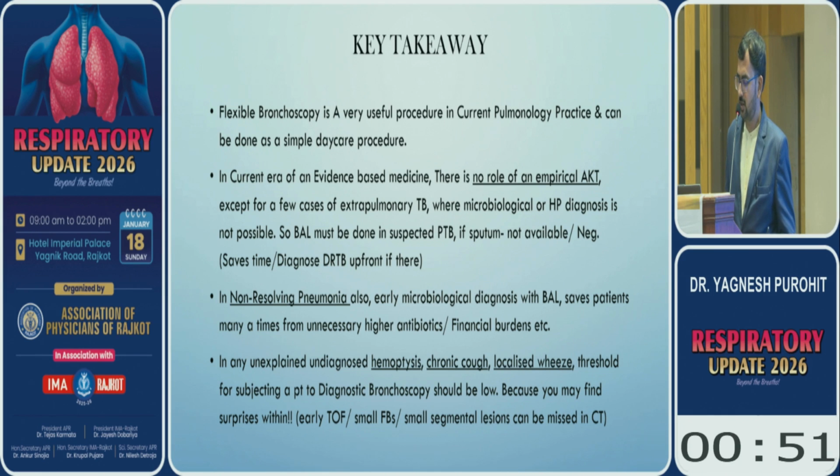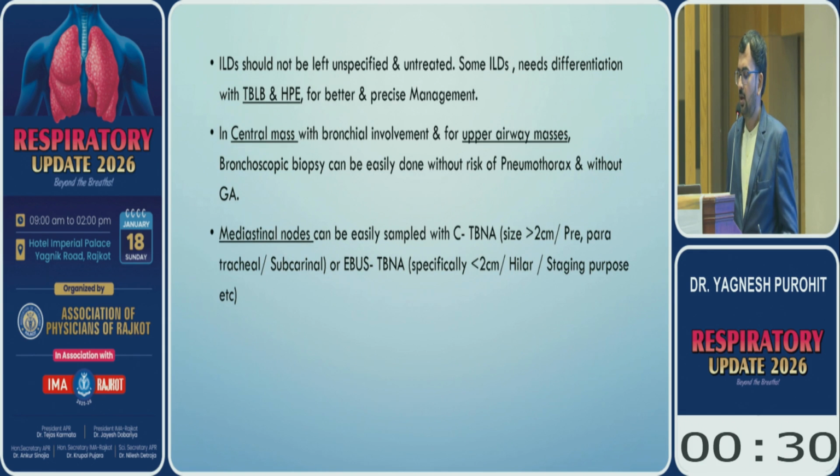In any unexplained, undiagnosed hemoptysis, chronic cough, or localized wheeze, the threshold for subjecting a patient to bronchoscopy should be low, because many times we find surprises within the airways, for example fistulas or small segmental lesions or foreign bodies which are sometimes missed in the CT. ILD should not be left unspecified and untreated. As I have told, fibrotic and non-fibrotic ILD should be differentiated and treated.